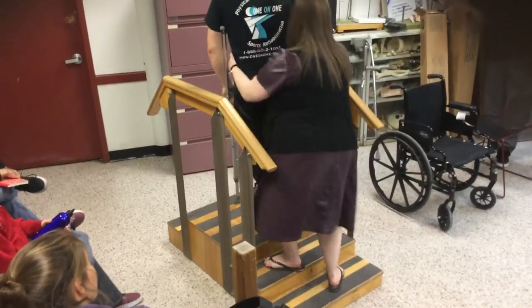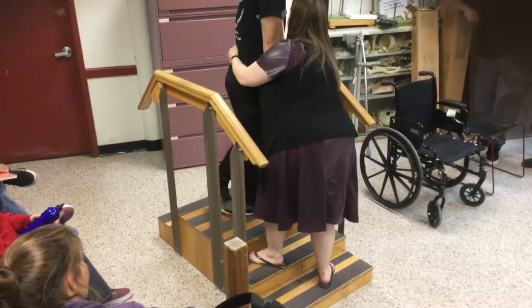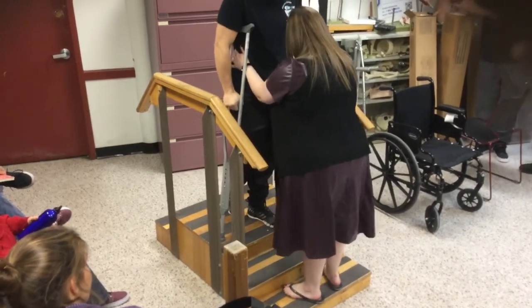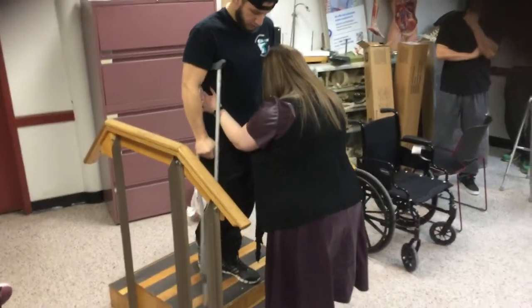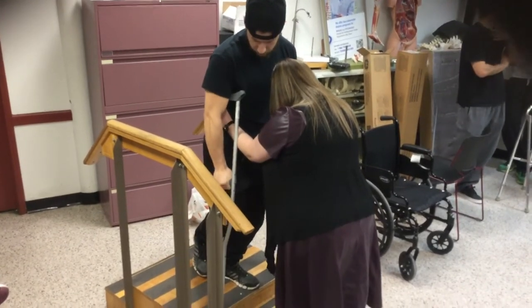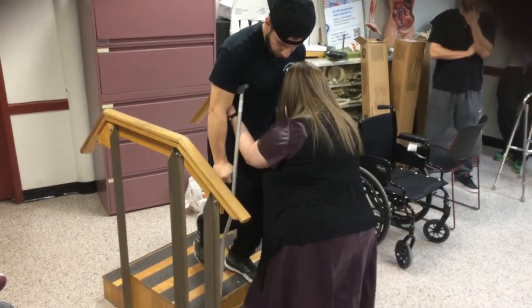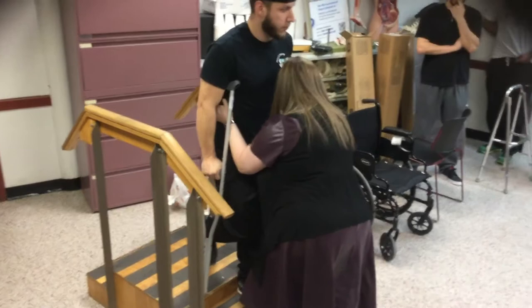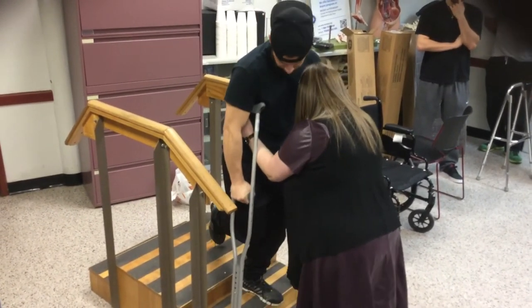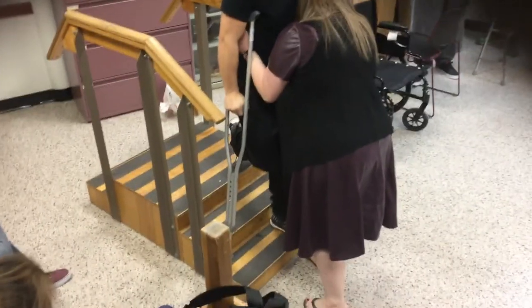Now we're going to turn. Good. You're going to bring the crutches down — that toes can't go over. So bring the crutches down. And we're going to hop down a little — hop. Good. Now bring the leg back. Good. Crutches. Hop.